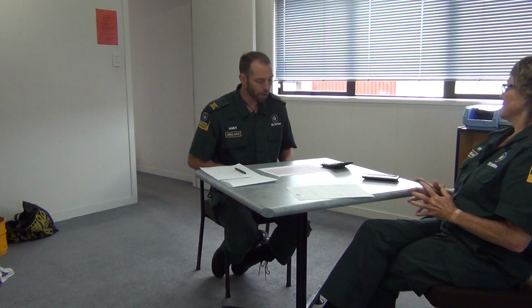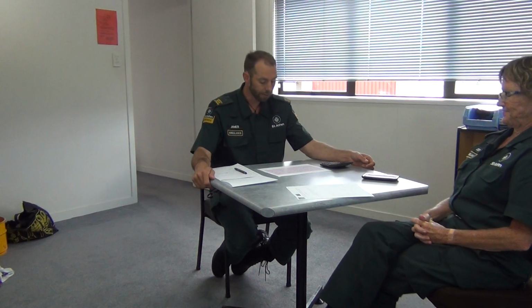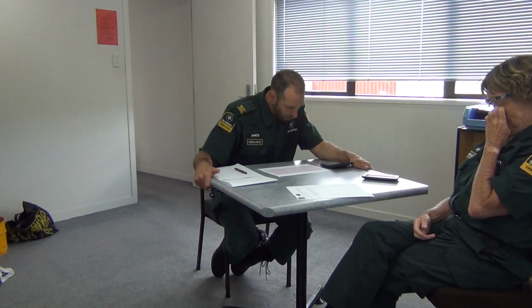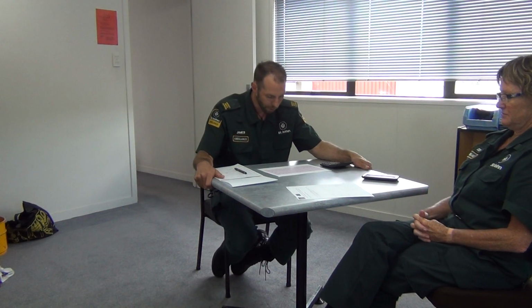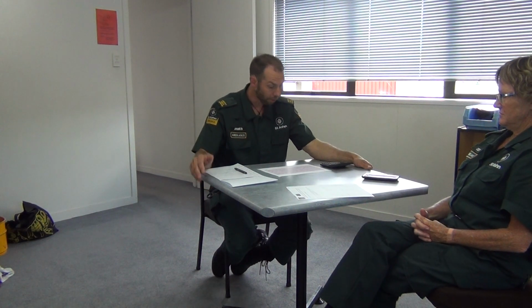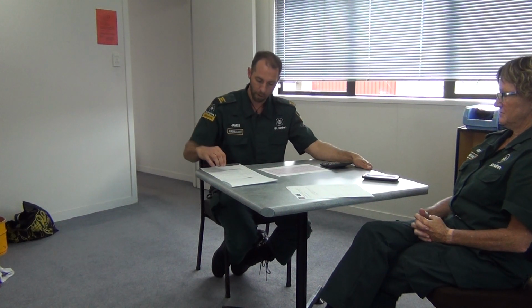Okay, so I'll start in the beginning. AVR, the vector is negative. There's a QRS complex in every lead. The R wave progression is late. The ECG is a good ECG, it's very clean. We haven't got a paper speed.